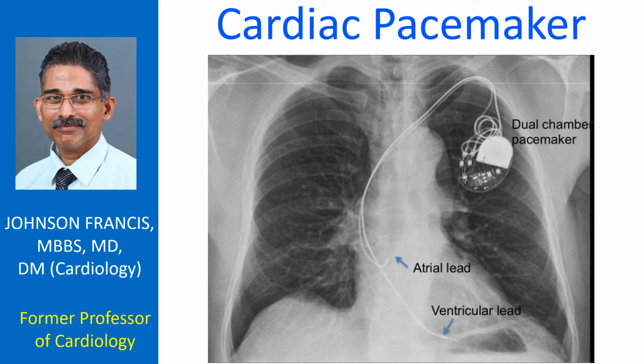Many malfunctions can be detected and managed by reprogramming the device. Battery status is assessed so that elective replacement time can be detected well in advance, usually several months ahead. Implantation and replacement is under local anesthesia.